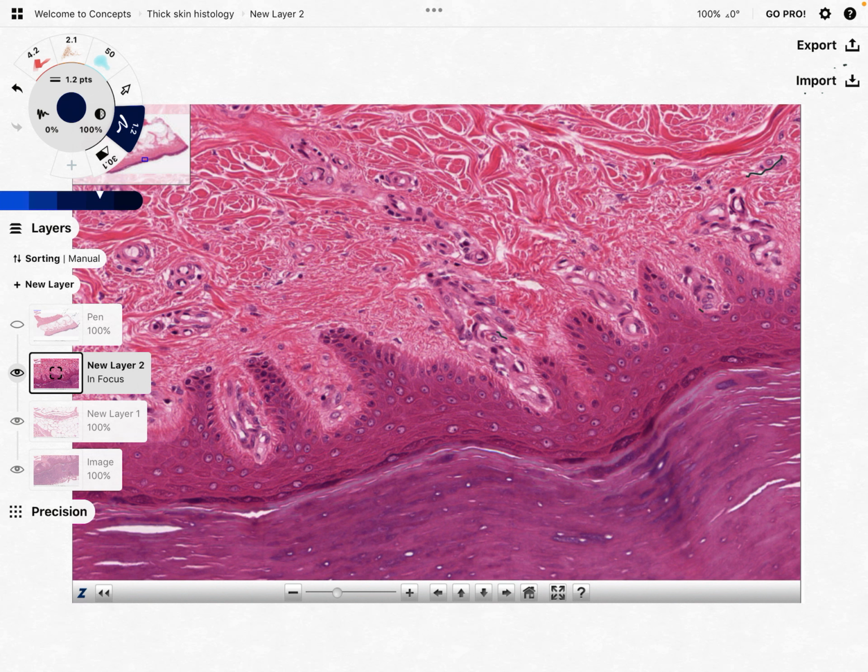All right. So one thing to talk about regarding the dermal layer, first, is how you can separate the end of the epidermis as it meets the dermal layer. As we see, we have all these little prominent ridges, these papillary ridges, projecting like little fingers into the dermis. All right, so this is the epidermis. And then, of course, everything beyond that is all dermis.